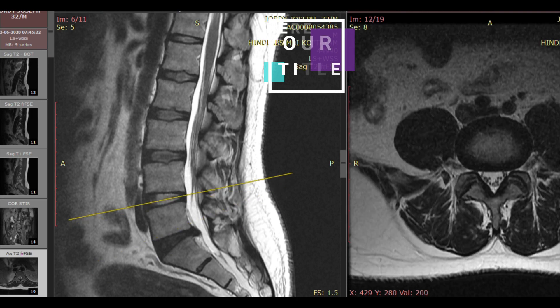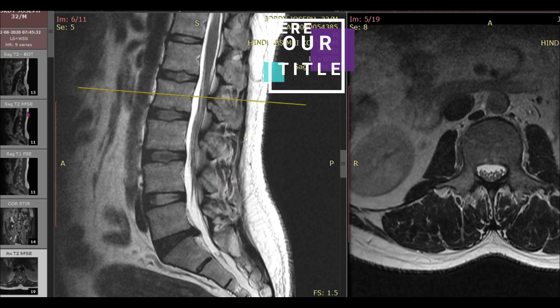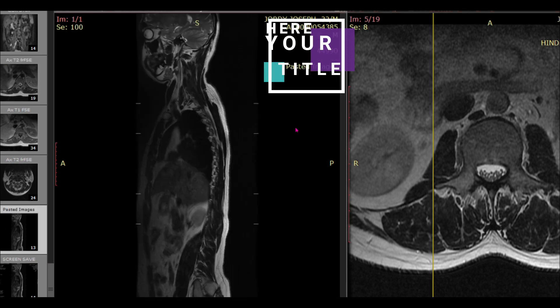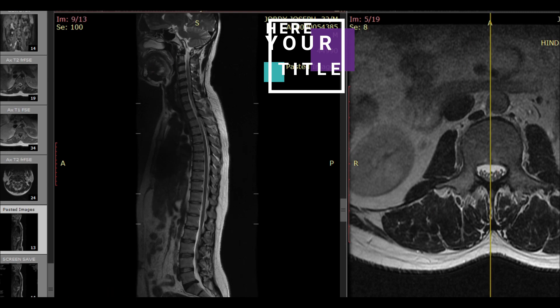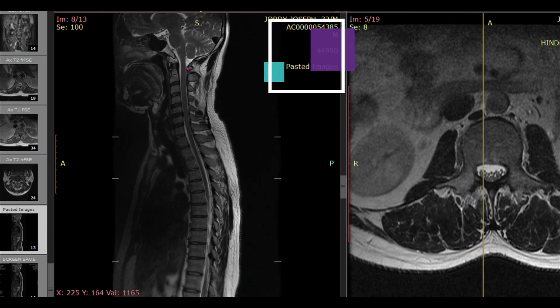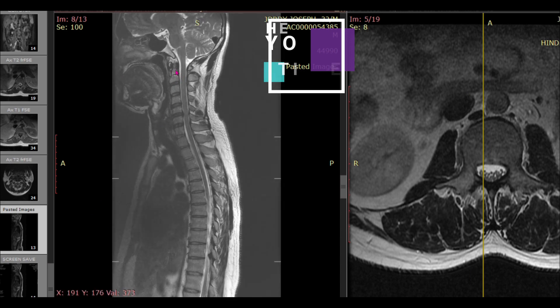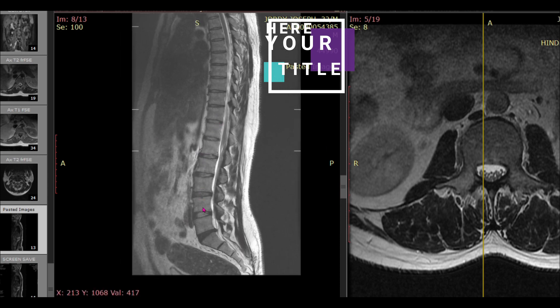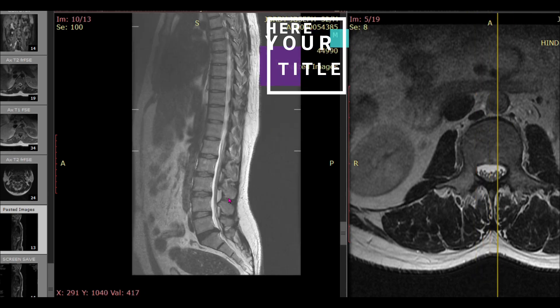Step one: first you have to rule out the presence of sacralization, whether it is present or not. In my center we ask the radiographer to make a stitched image, which looks like a pasted image. Using this image, you start counting from the top to bottom — from the cervical spine — so here: C1, 2, 3, 4, 5, 6, then T1 through T12, and L1, 2, 3, 4, 5.